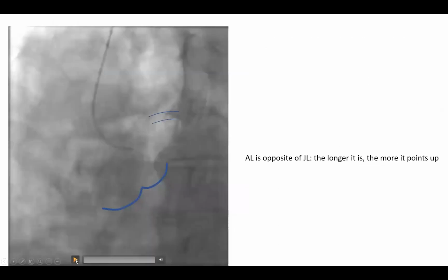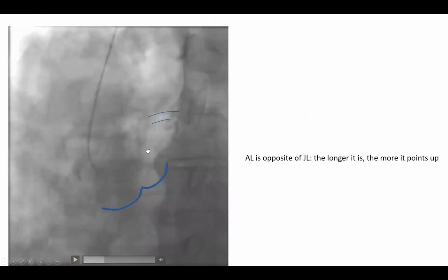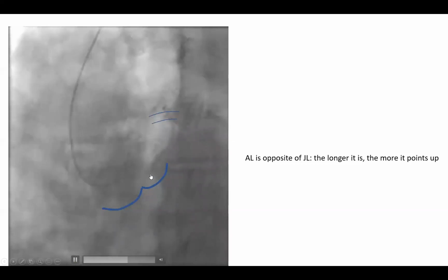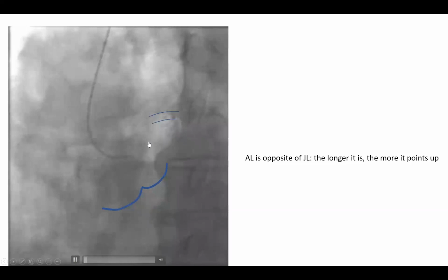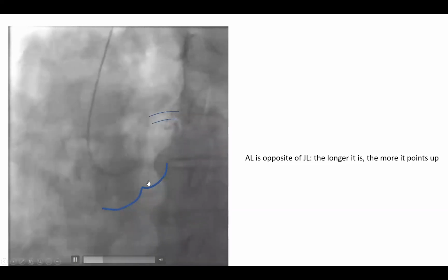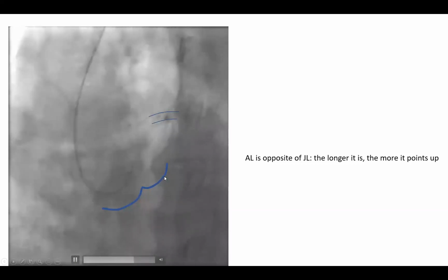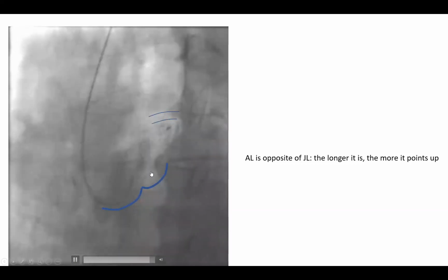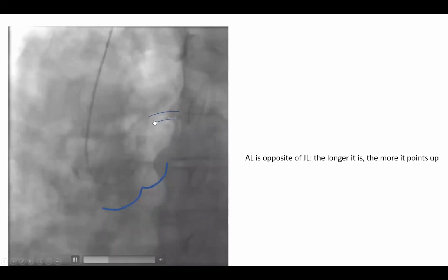So this is an illustration of a case. This is an Amplatz left 2 that we use to engage a left coronary. This is a patient with a large aorta in the 5 centimeter range. So look at this. We hooked the tip in the left coronary, then got it free, then kept pushing it to try to reach. But what can you tell here? I'm imagining those cusps in my brain as I do during all my engagements. So what can you do here? We did a puff and we were way below the coronary.